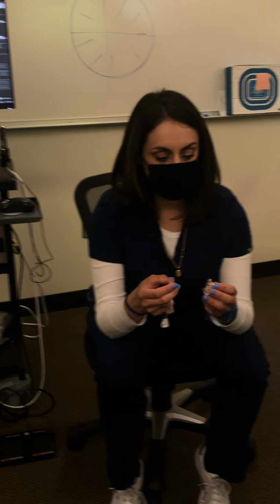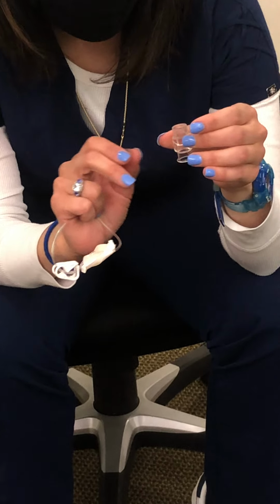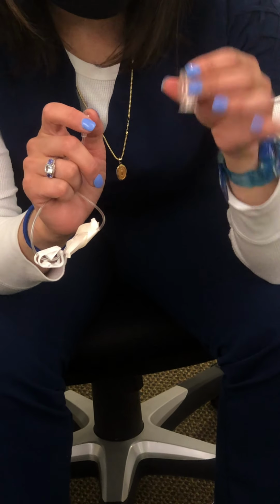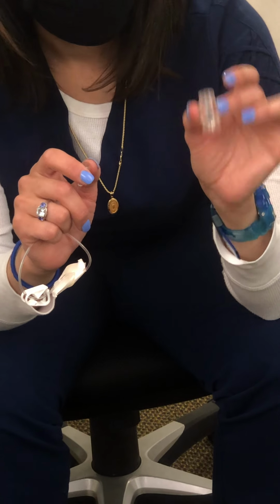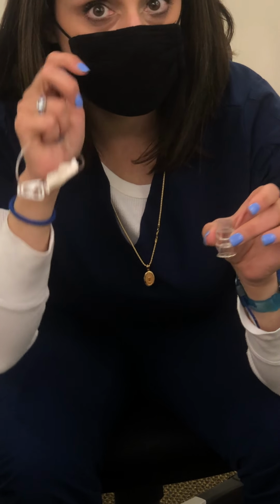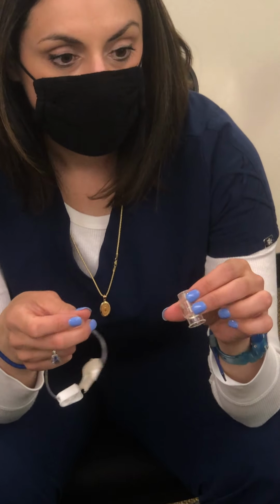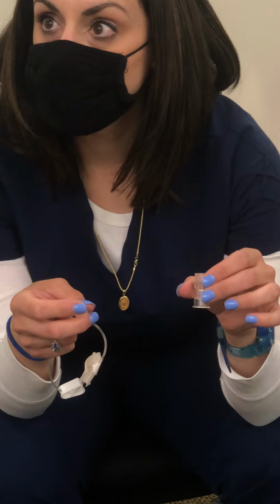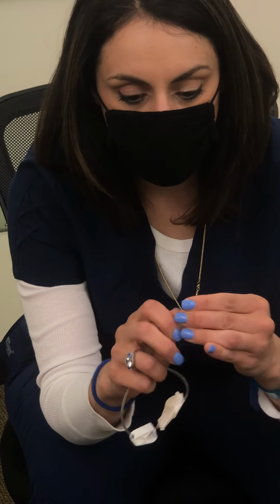With this, this little flange is gonna go underneath the eyelid. Sometimes you can just fit it in there without lifting the eyelids out of the way, but I find that that doesn't create a good seal. So you want to lift the bottom lid a little and make sure you have a good seal. And like you were saying, if you don't put any pressure on it, your water's gonna leak out all over the place.